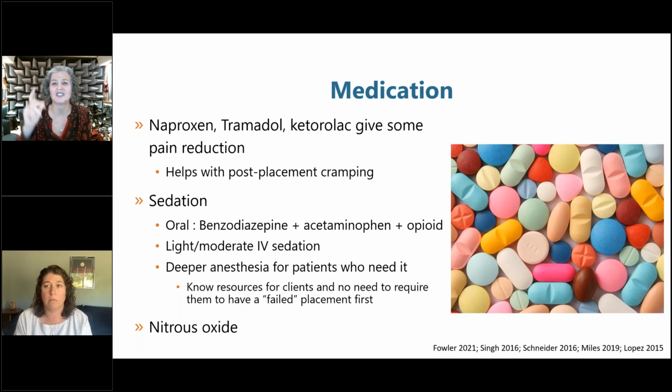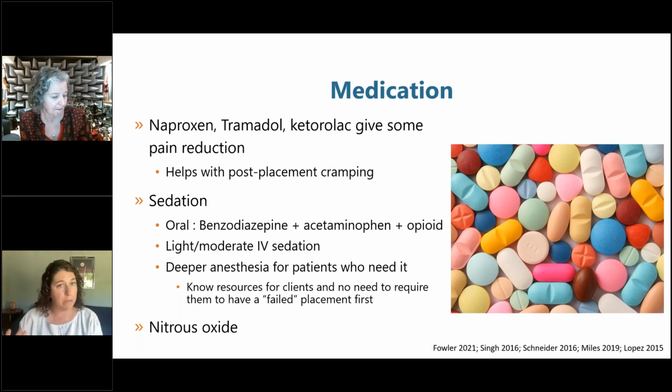And certainly if you're just spraying willy-nilly from the outside, that means everything has been sprayed and potentially can sting, but also it's cold. So you're basically spraying a cold, wet thing into the vagina. So if you're going to use topical lidocaine or topical anesthetic, think about lidocaine-prilocaine as the choice, and really limiting it to the cervix, not on the vagina at all. Spare it, possibly.